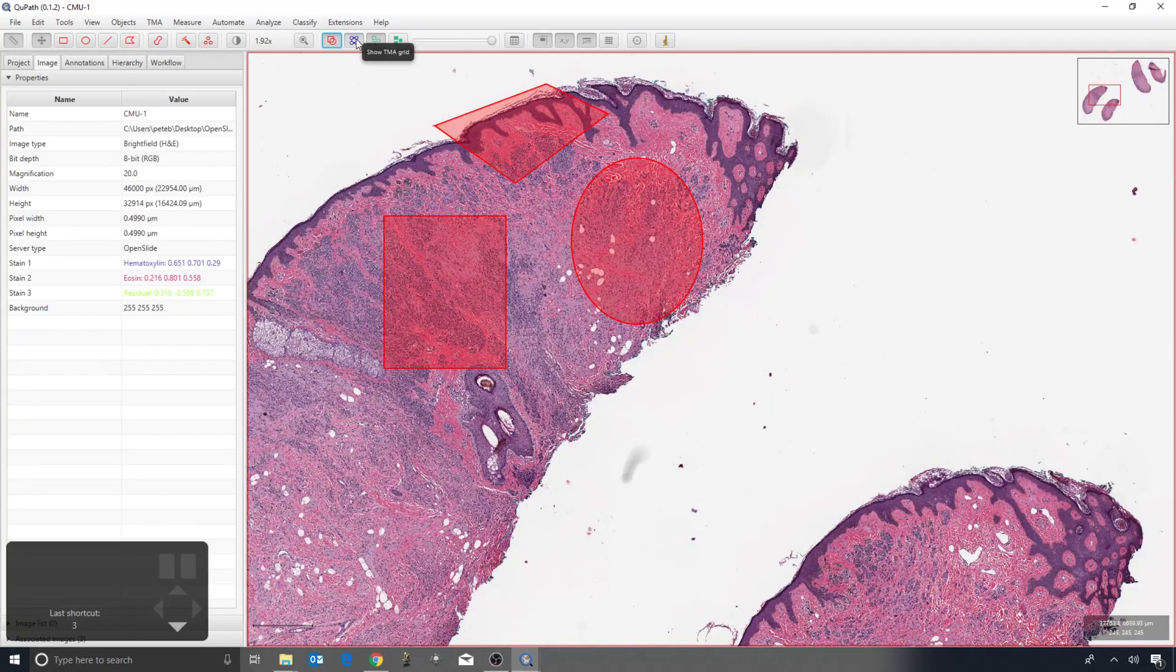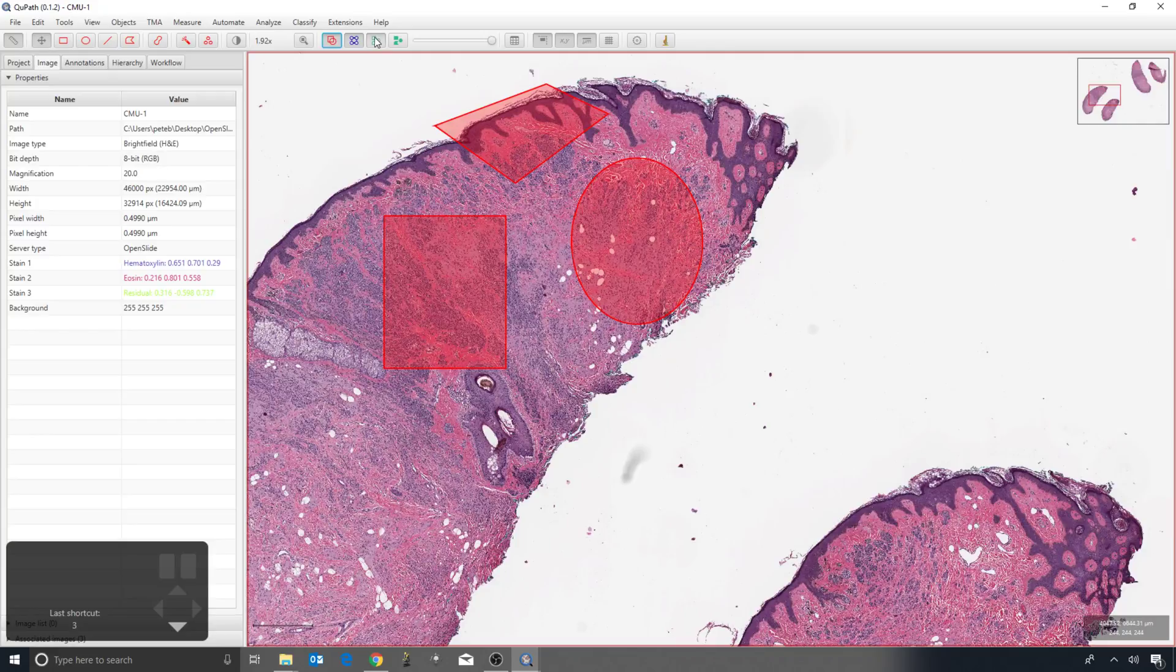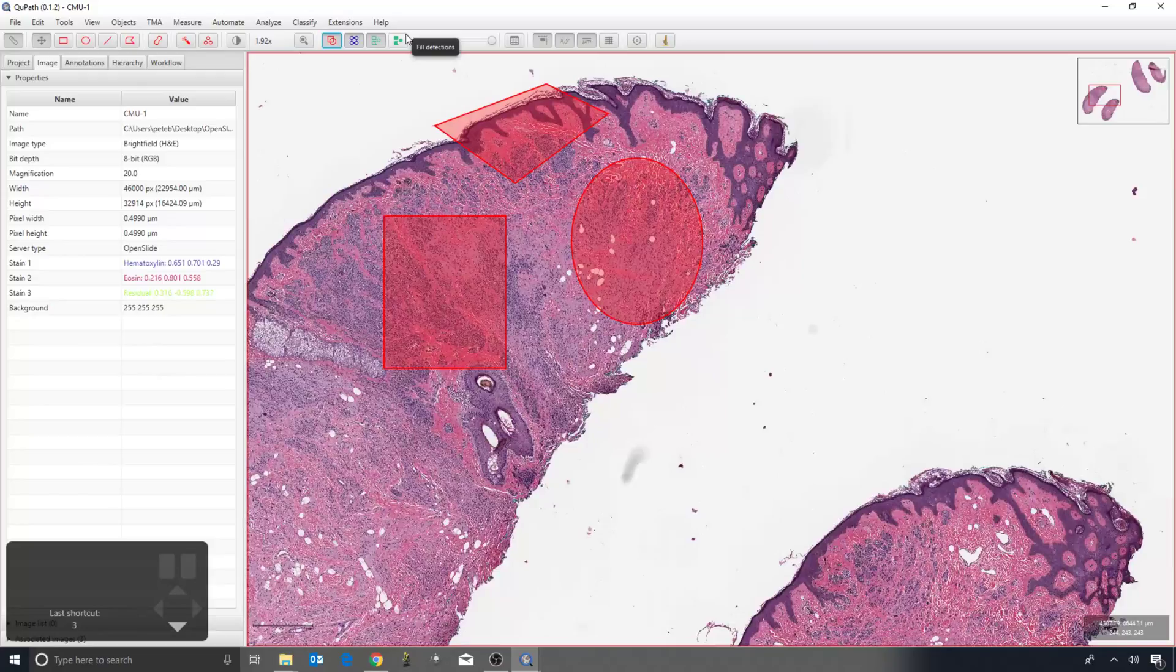The next one is if you have a TMA grid, it will toggle on and off the grid. Then the following ones will toggle on and off detections, which will come to later, but that's basically things like cells.